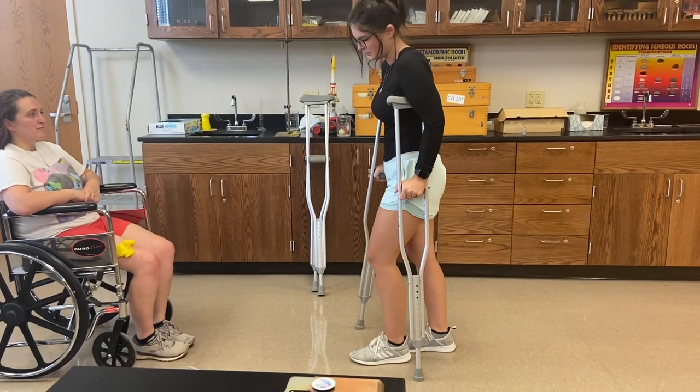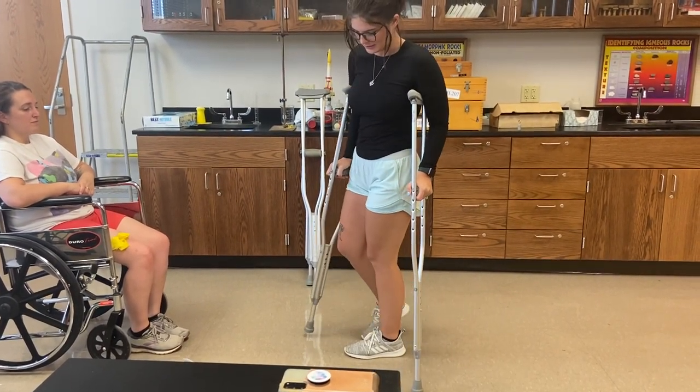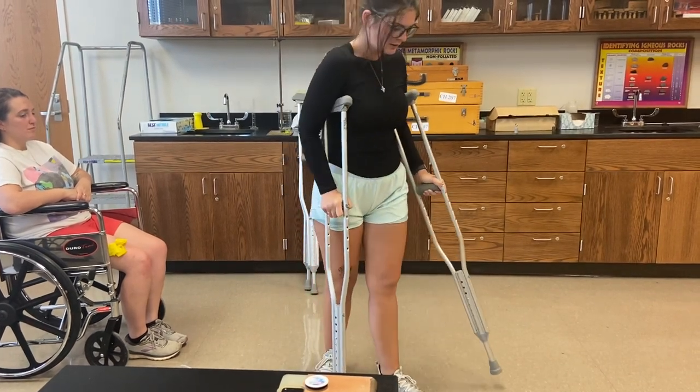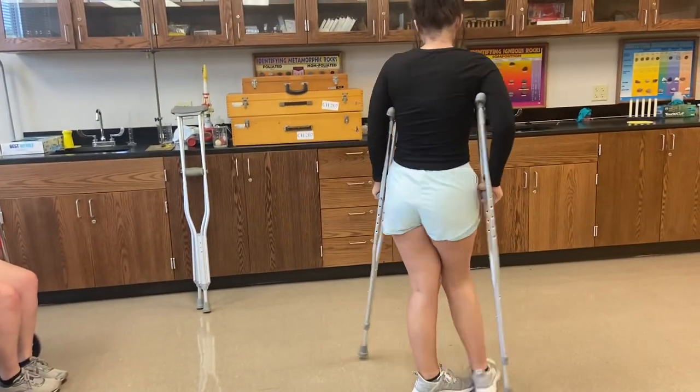And then you're going to turn towards your good side, which is your left side. You're going to do crutch, bad leg, crutch, good leg, crutch, bad leg, crutch, good leg. Does that sound okay?